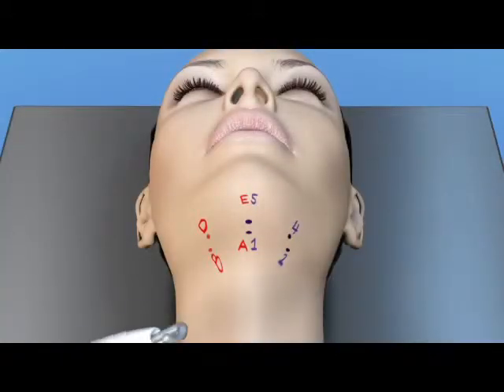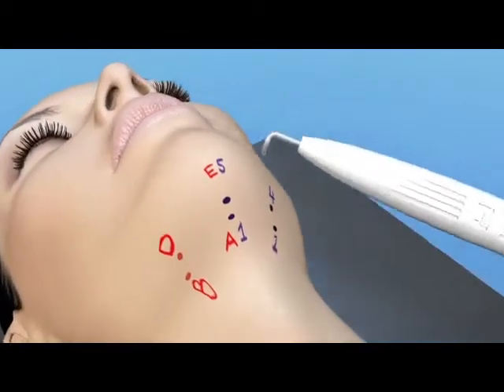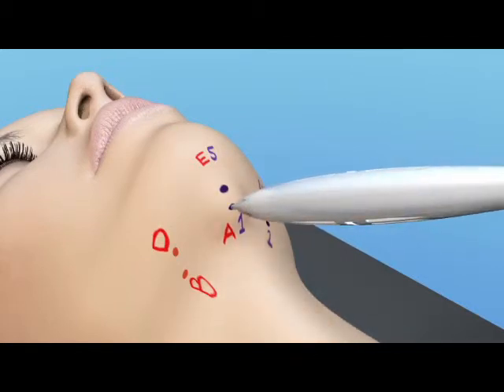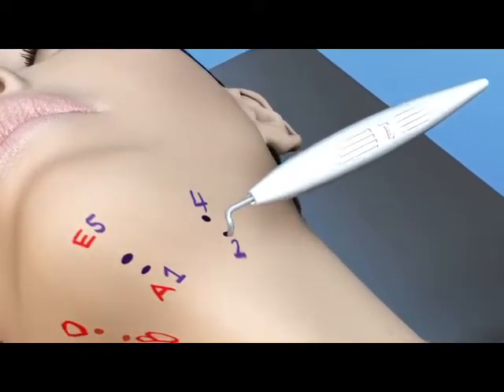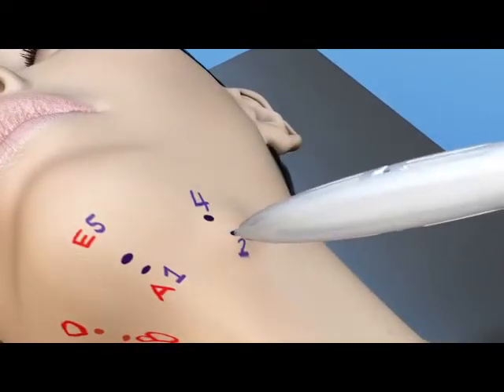The dermal attachments around each puncture site are cleared using a clearing device. The design of this tool was such that it needed to be rotated in a clockwise fashion in order to allow the sweeping away of the ligamentous attachments around each puncture. This will allow the easy passage of the suture rod in and out of each puncture as the suture matrix is weaved underneath the neckline.